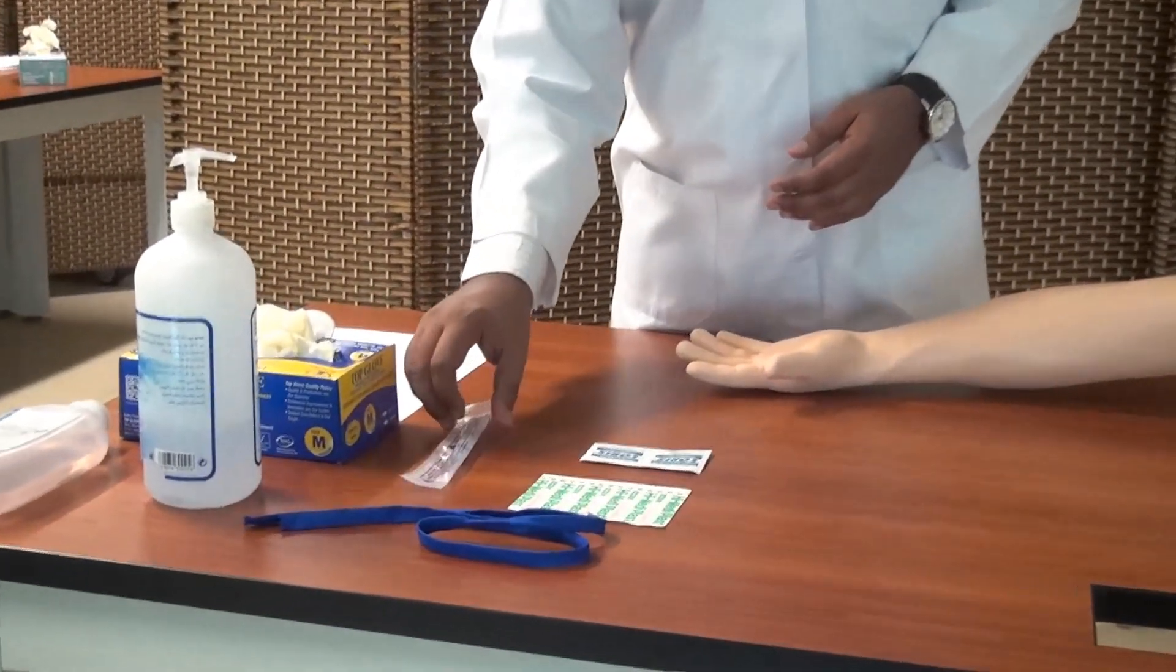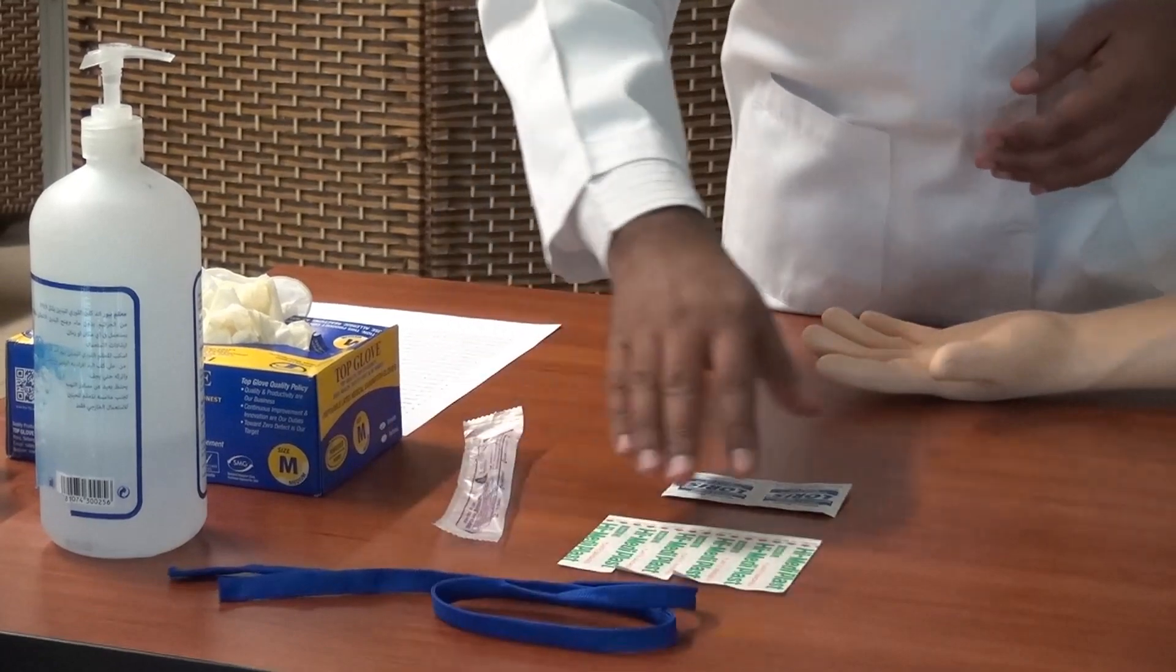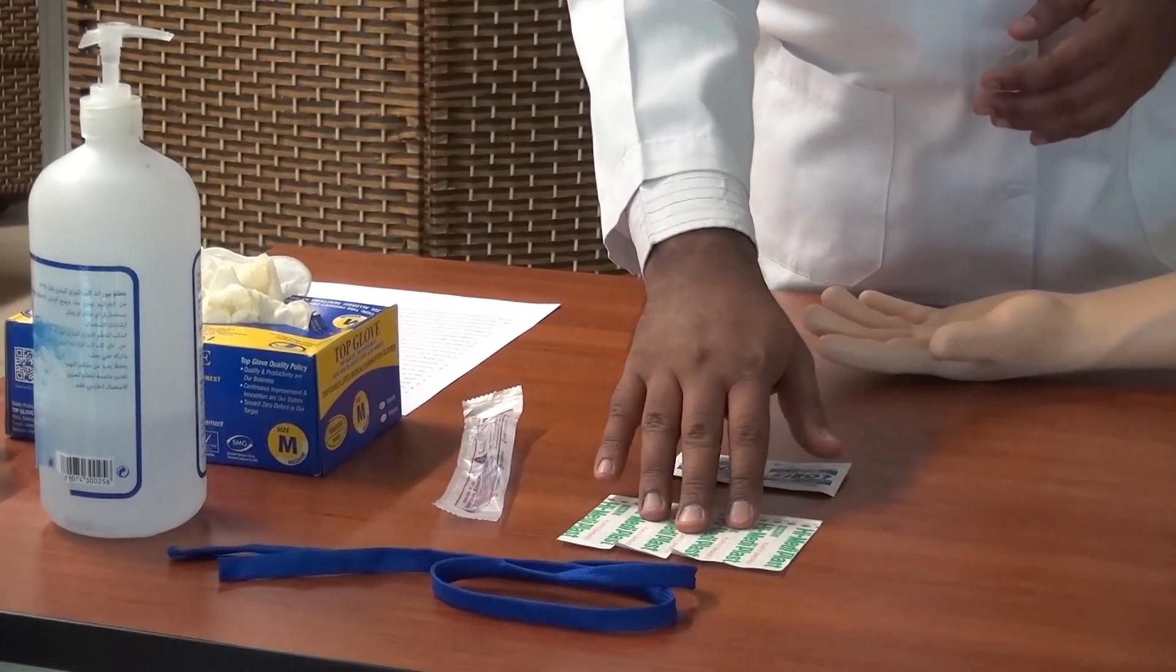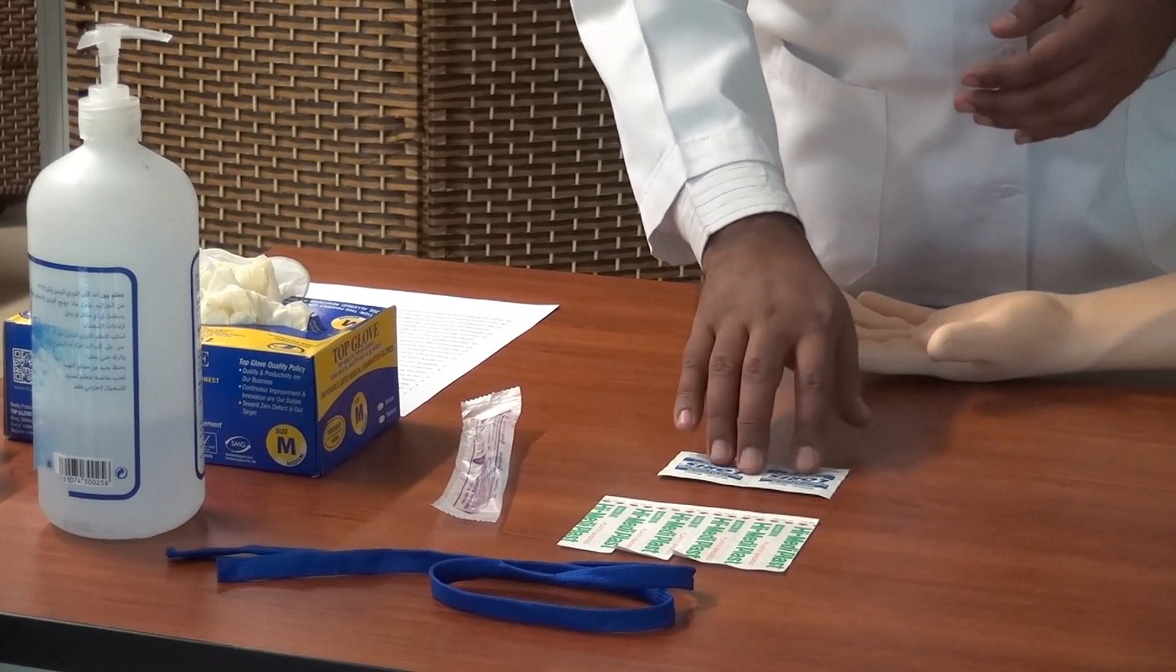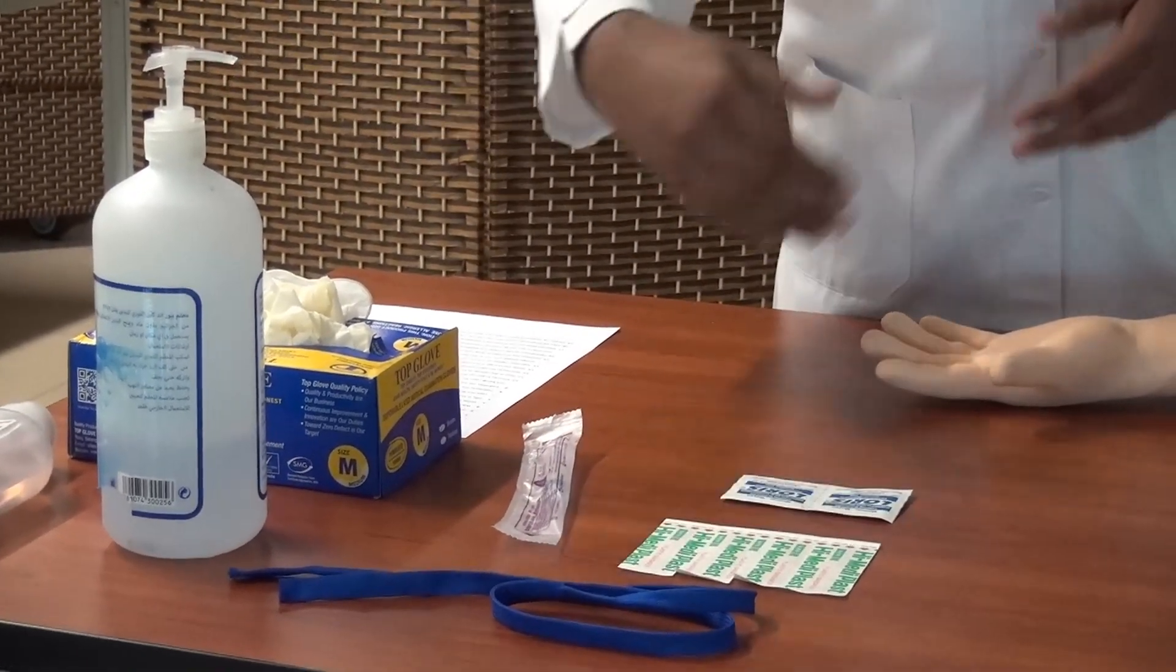This is the typical disposable syringe, the tourniquet, the bandage which you apply after the intravenous injection is over, alcohol swabs, gloves, and a sanitizer to clean your hands.